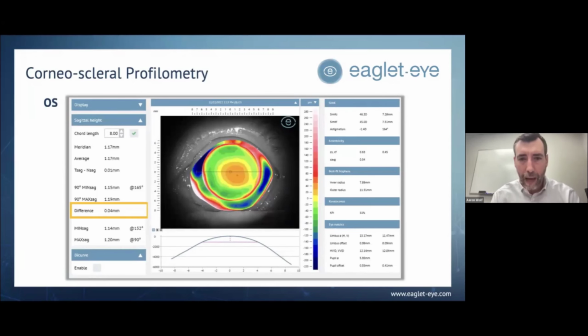This is the map for the left eye. Again, you can see I have highly reliable, high quality maps of the cornea. Maybe not as much beyond the cornea at maybe 1 o'clock, but I don't care about that because I'm not fitting a contact lens out there. So I really am not concerned with the quality of that data. Just within the cornea. The metrics also show a normal curvature, eccentricity, elevations minimal. Okay. These are very nice corneas, should be very predictable.